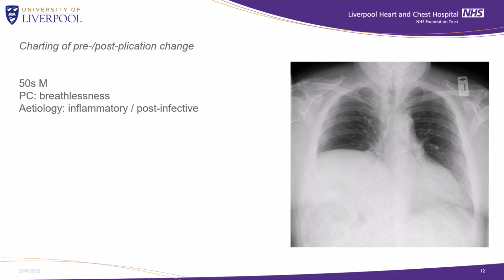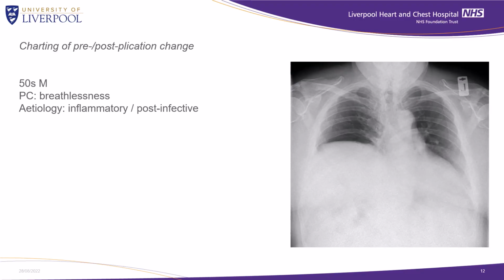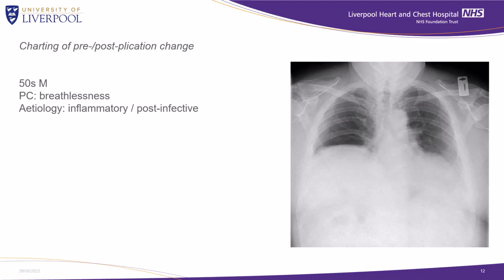We've also used DDR to observe the change in diaphragm function associated with plication surgery, for example in this gentleman with palsy of a post-infective etiology. Again, you can see clear paradoxical motion on the right during sniffing, along with a full expansion, high-quality PA imaging of the chest produced by the DDR machine.